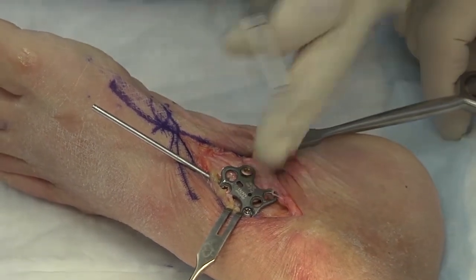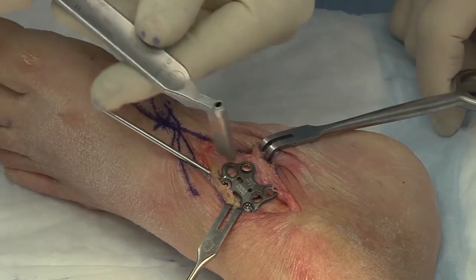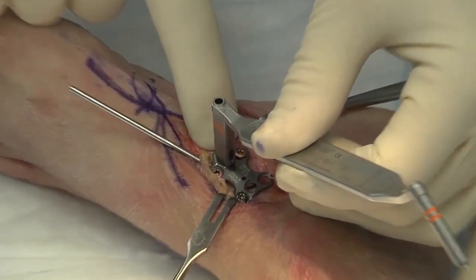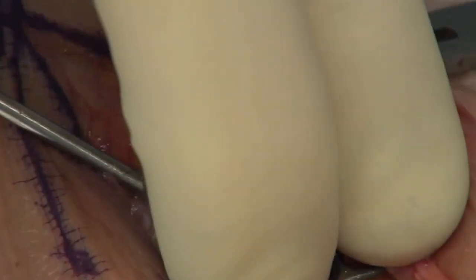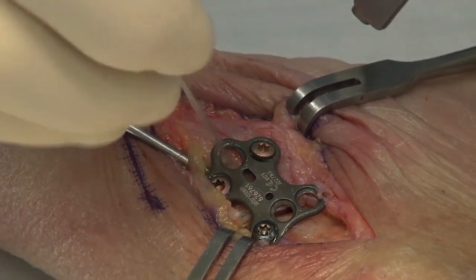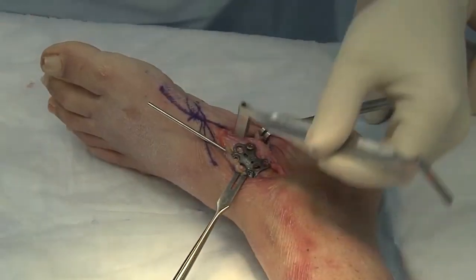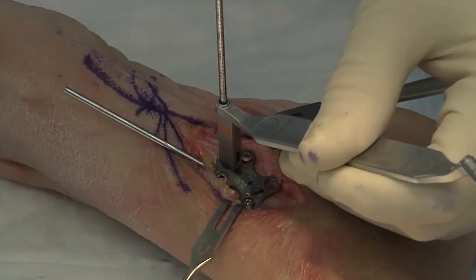Another option with this plate is that there is a compression screw hole available. In this situation, your compression will be obtained directly through this compression screw hole. You'd place your proximal screws first, put your K-wire in the dynamic K-wire hole, and then place your compression screw. This compression screw hole can accommodate either a locking or a non-locking screw.